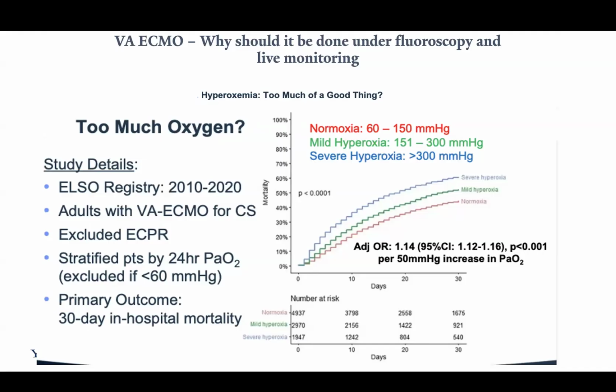So I thought I had something about north-south syndrome here, but since you mentioned it, Ravi, why don't you tell me what that is? So from my understanding, basically, when the LV is not venting enough, initially you don't have any LV venting, but when the heart functions and recovers, you start getting these different mixing pools. And you worry about distal limb perfusion, especially depending on where your mixing pool is. And that's why a distal right radial art line, which bypasses the mixing pools, will give you an idea of how you're oxygenating.